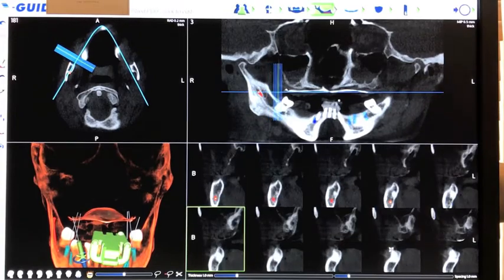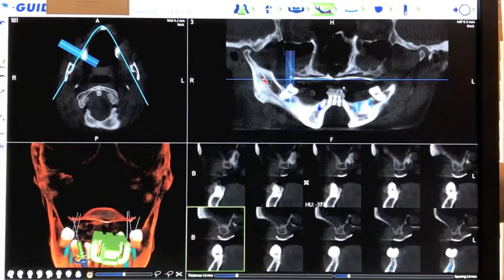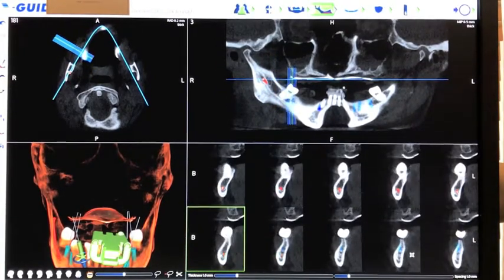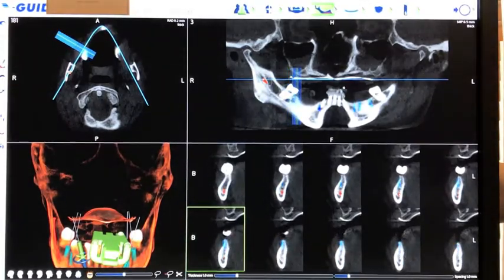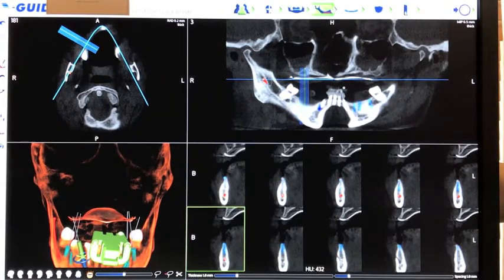Now that the patient has been determined to be a good candidate for placement, a new scan is taken with the patient wearing the X-clip, which appears green on the front of the bottom teeth.